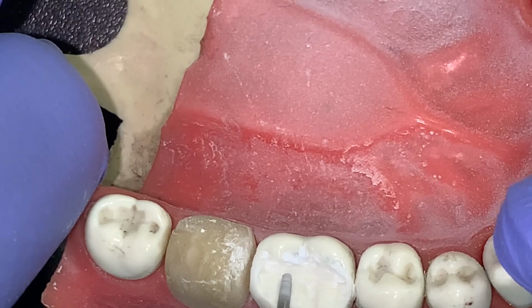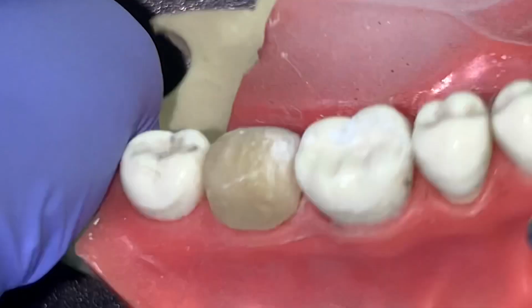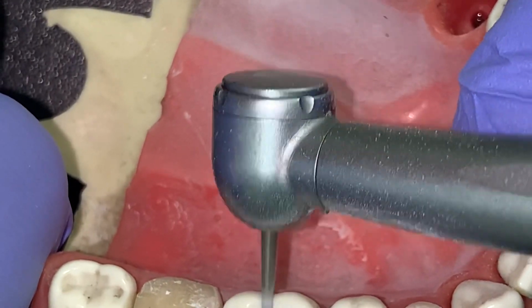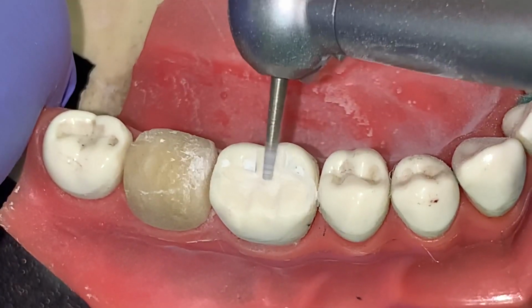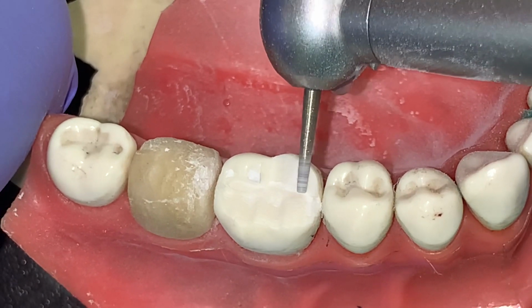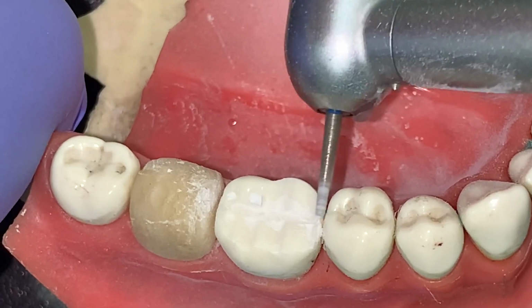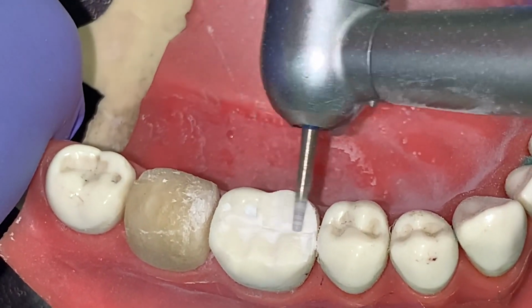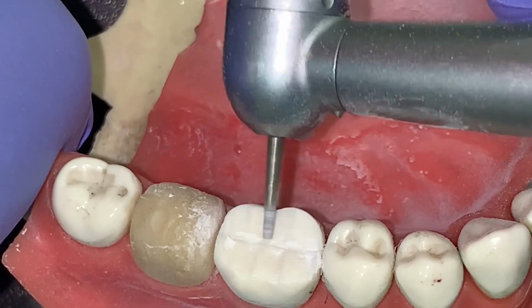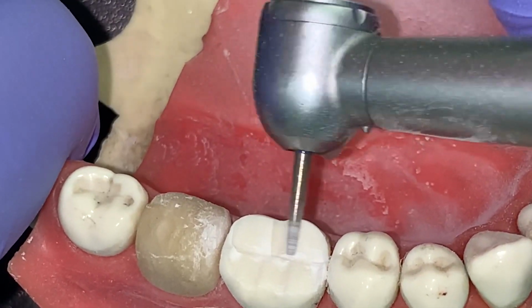I usually do the occlusal reduction as my first step. Now, when you are doing a vital tooth preparation, you have to be careful with the tooth's anatomy. The overall tooth preparation should look like a smaller tooth, just that your preparation will not have an undercut. So your tooth reduction finally should look like a smaller tooth, just without any undercuts.